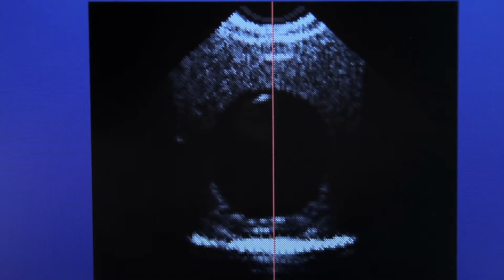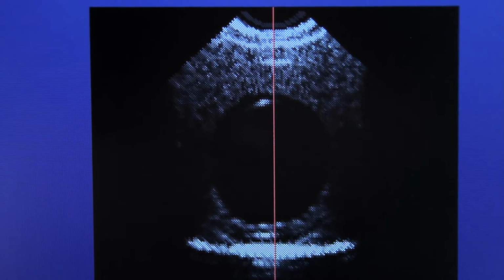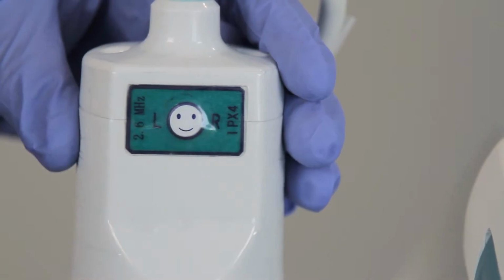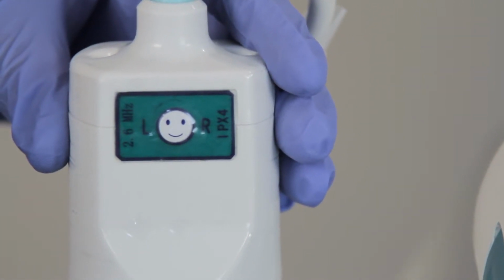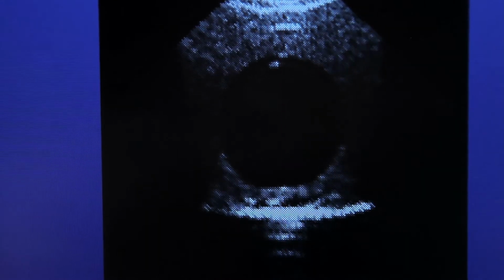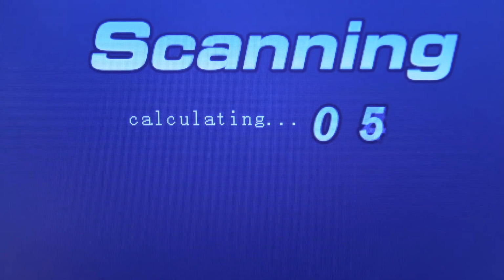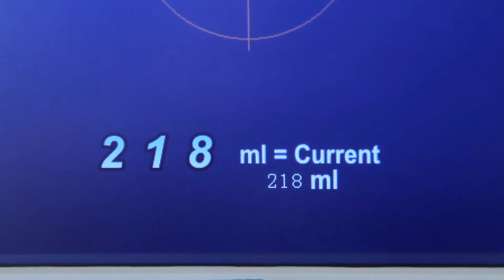The dark area represents urine and must cross over this central line in every scan. When you are ready to scan, press the Scan key on the control panel or the smiling face button on the probe to scan the bladder. Do not disturb the device during scanning. The scan time could take up to 10 seconds for a 12-image scan and up to 20 seconds for 24 images. The scanning progress will be displayed during the course of a scan.